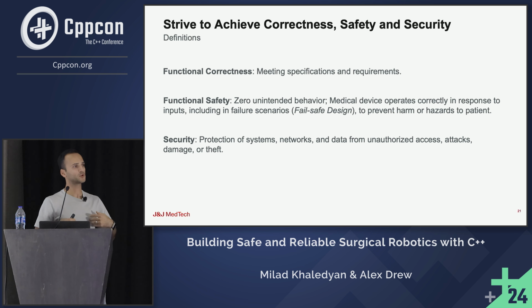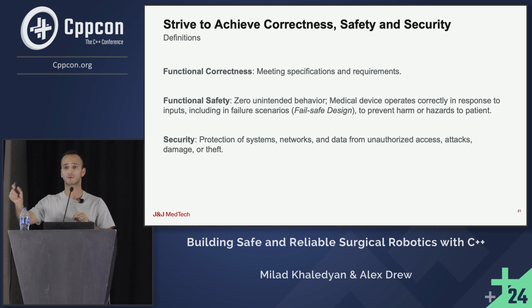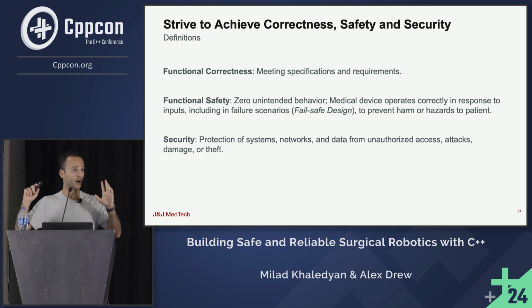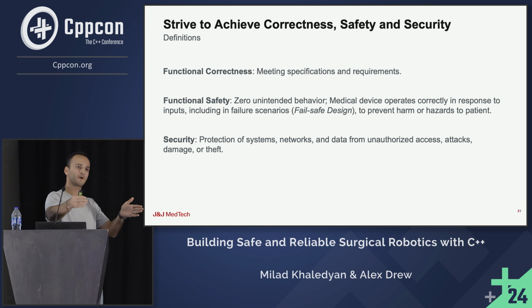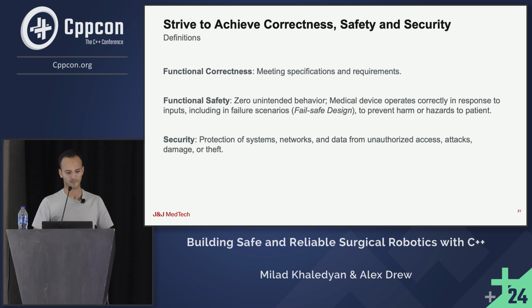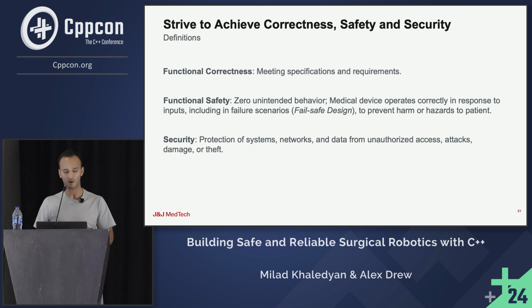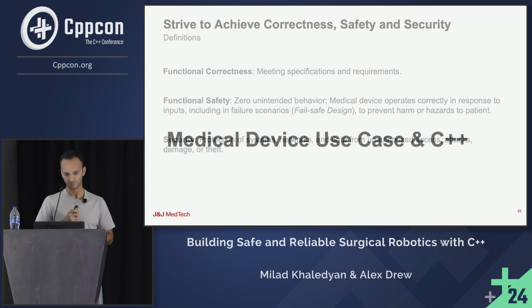Functional safety means zero unintended behavior for the medical device. The failure could happen, but the system has to fail safely. If I give an input to the system, I expect an output, but I cannot prevent every single failure, right? The system could fail, but I have a fail-safe design in place. So if every single layer fails, probably I have some hardware level that prevents me from injuring the patient at the end of the day. And security is protection of the system, network, and data from damage, theft, unauthorized access, and attack.